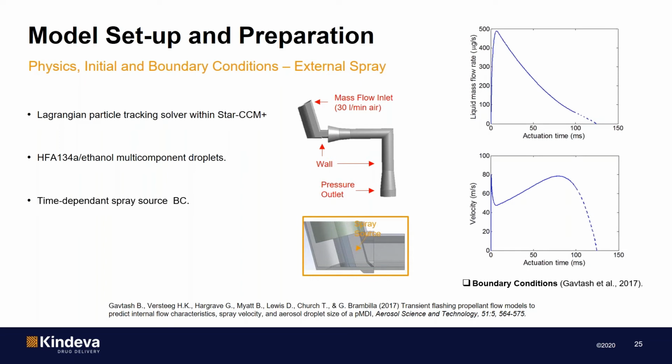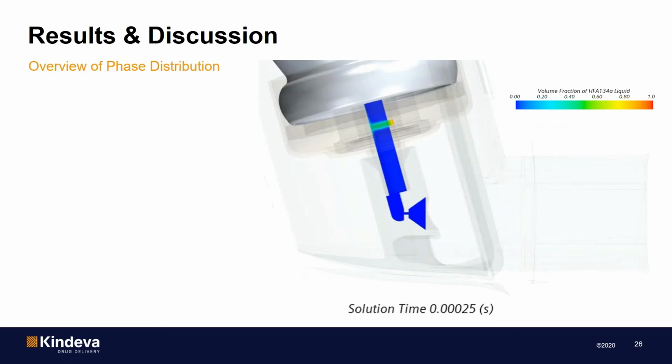And the pMDI cloud basically undergoes a rapid evaporation with strong heat, mass, and momentum transfer in the near-orifice region. And to be able to capture these strong interface phenomena, we use a two-way coupled algorithm in STAR-CCM+ to capture the effect of the particles on the surroundings. Now, moving on to the results of our simulation.